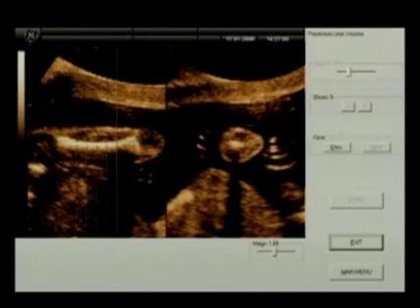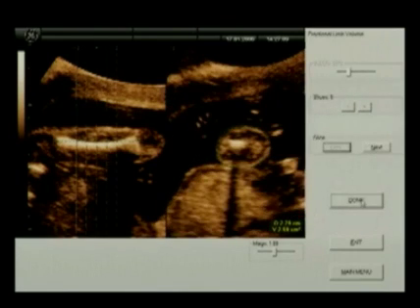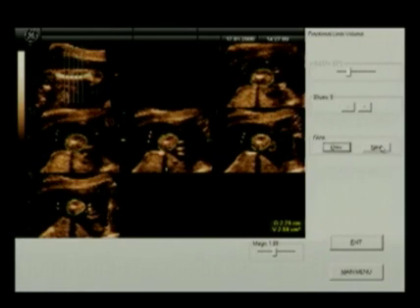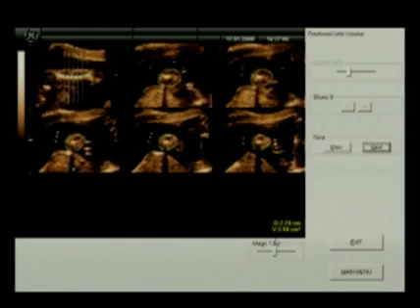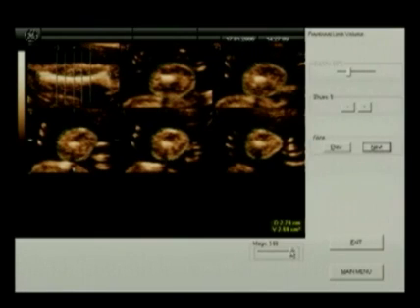fifth one here, and then once this is finished, essentially you have the option of going back and correcting, as you can see here, correcting a manual trace. And once you finish that, you can say done after reviewing your slices to get a tomographic view of all the 5 slices to make sure that that's what you're happy with. And the fractional limb volume in this case would be 2.6 milliliters or cubic centimeters.